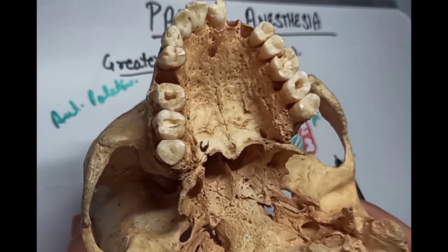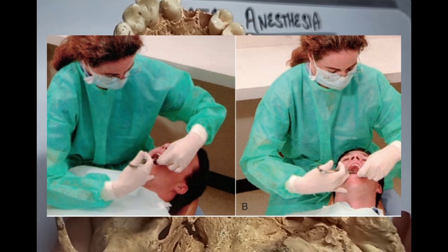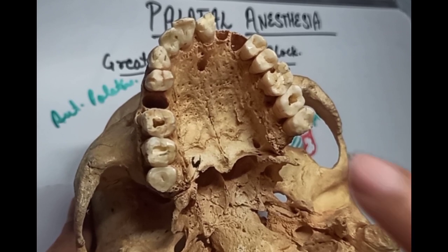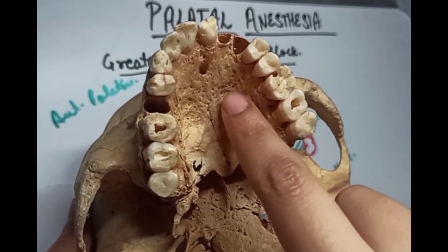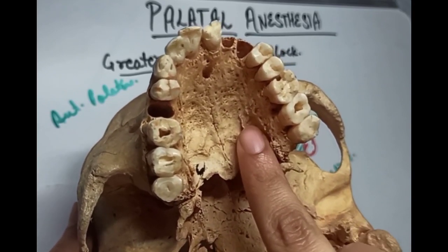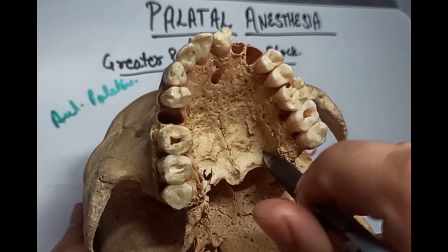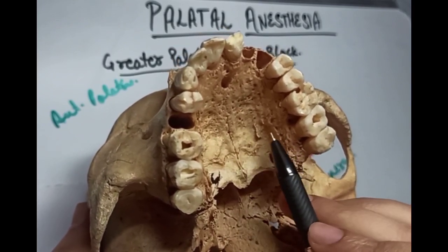Now let's see the technique for the greater palatine nerve block. For a right GP block, the right-hand administrator should sit at a 7 o'clock or 8 o'clock position, whereas for a left GP block, a right-hand administrator should sit at the 11 o'clock position facing the patient. To locate the greater palatine foramen, place the cotton swab at the junction of the maxillary alveolar process and the hard palate, starting in the region of the first molar area. Proceed posteriorly by firmly pressing into the tissues with the swab until it falls into a depression created by the greater palatine foramen. This foramen is mostly located distal to the maxillary second molar, about 1 cm from the palatal gingival margins towards the midline.